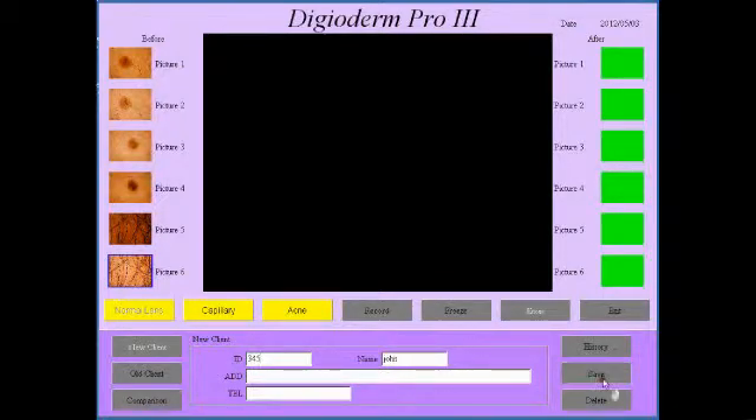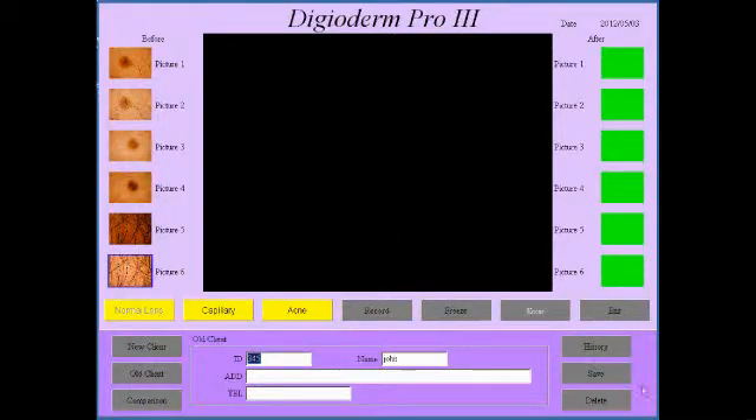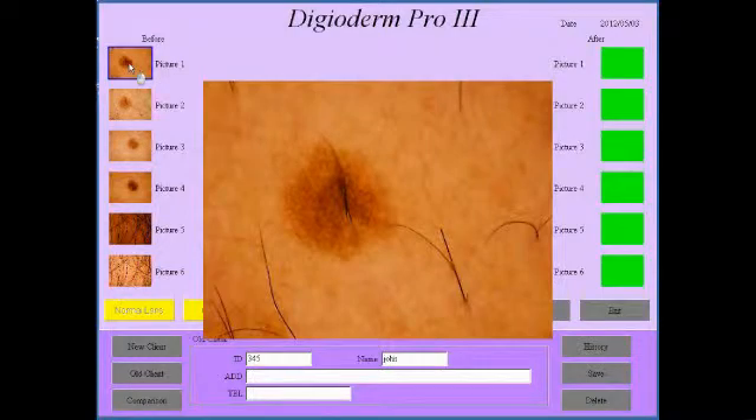4, 5 — save. And that saved successfully. So that's how simple and quick it is to actually take images with this. You can obviously go and click on one to zoom in on it.